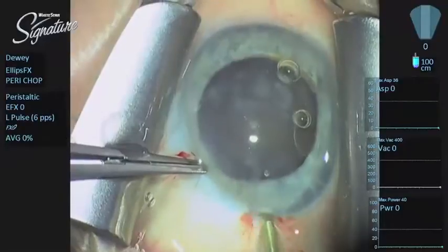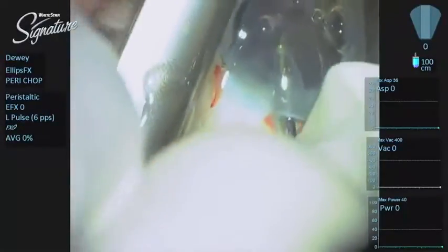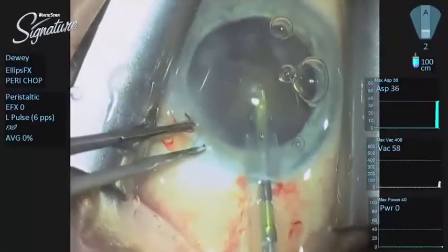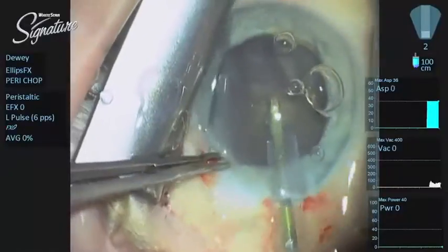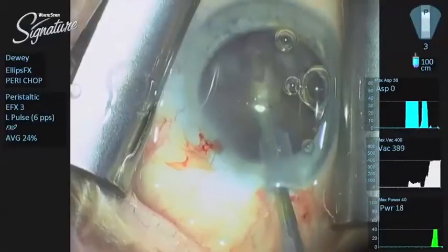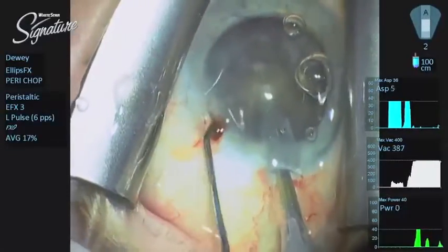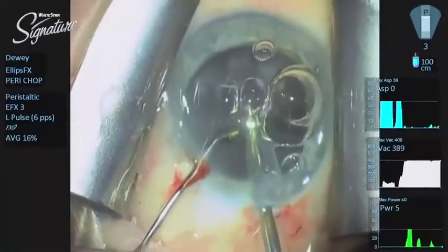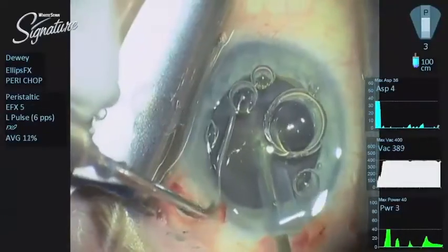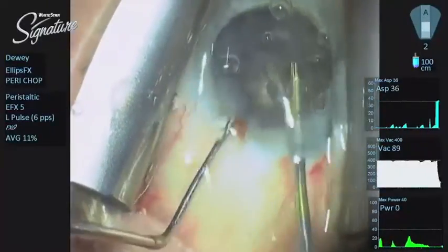In this case I am using a straight needle — I did not use a straight needle until completing a study. I actually oriented the irrigation sleeve, because one of the things I observe very frequently, even with doctors at the podium, is that they will not have the orientation of the irrigation sleeve correct. I really do not like to have the irrigation pointed straight at the corneal endothelium. I am using Perrier for my irrigating solution today — so we got a couple of bubbles, we're going to get rid of those.